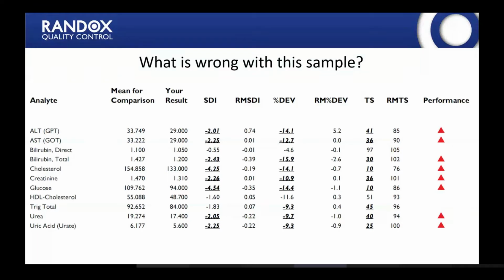So this is another summary page, and as you can see this time we have a lot of red triangles. This is what you don't want to see on your report whenever you turn to the summary page, because this means that there has been an issue, a big issue. Everything's flagged, well, almost everything's flagged. When we see this number of red triangles, it usually means that there's an issue with the sample.